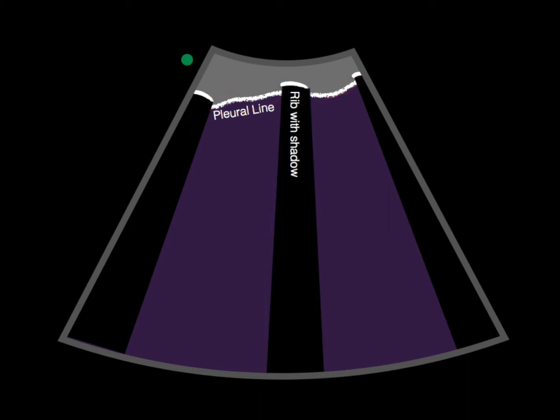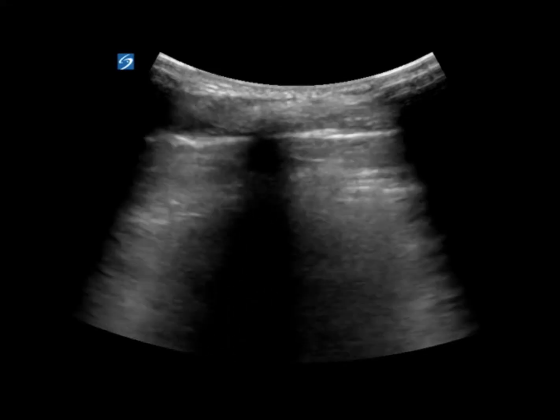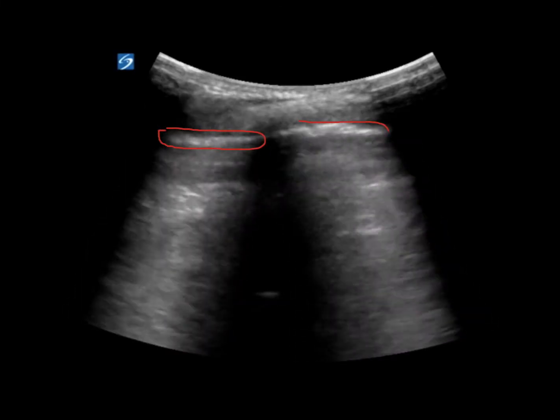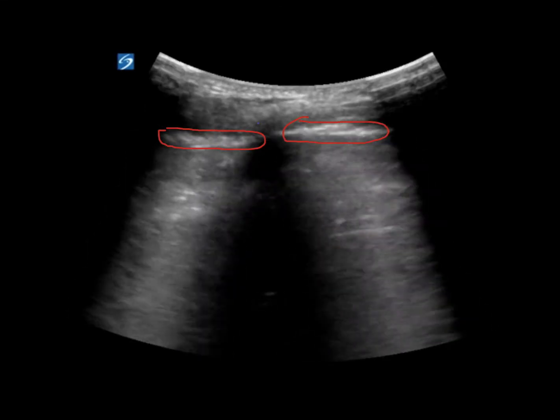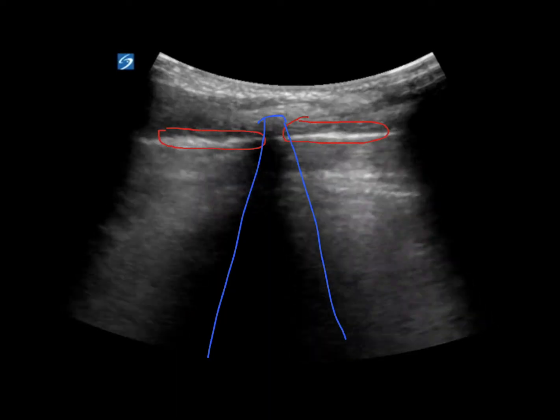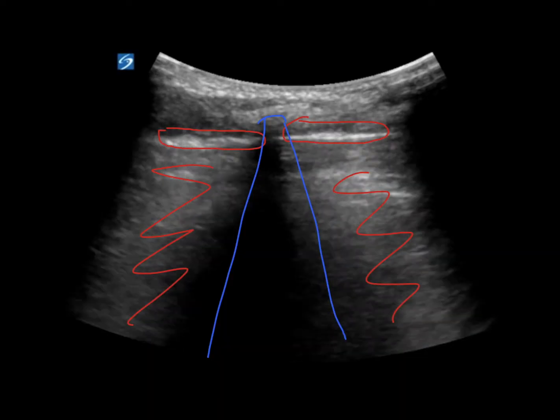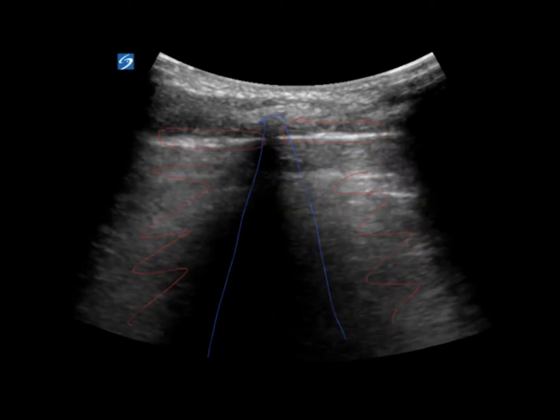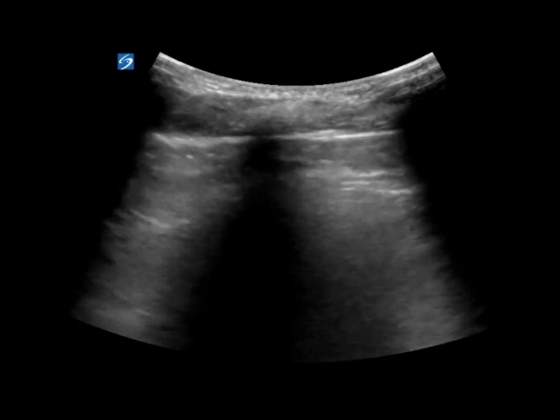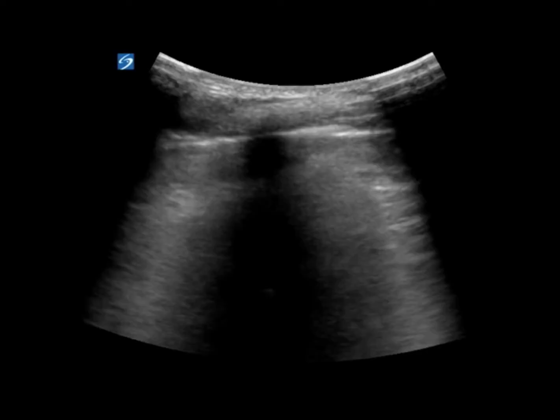Everything else below the pleural line is going to be disorganized. In this image, we can see our pleural lines right here — those bright white lines — and lung sliding. We have our rib and rib shadow. Deep to the pleural lines, it's all disorganized; we can't make anything of it. This is what we typically see on a normal lung ultrasound, because those ultrasound waves get past the pleural line, enter the air, scatter, and don't make it back to the probe.